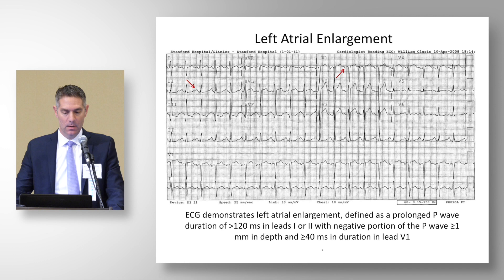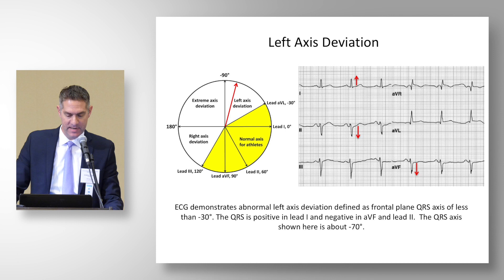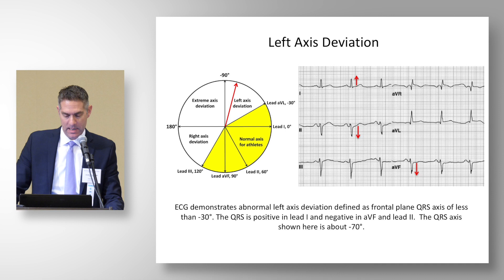An example of left axis deviation: the QRS is positive in lead one but negative in lead AVF and lead two, suggesting the axis is leftward of minus 30 degrees — qualifying for left axis deviation, in this ECG approximately minus 70 degrees.